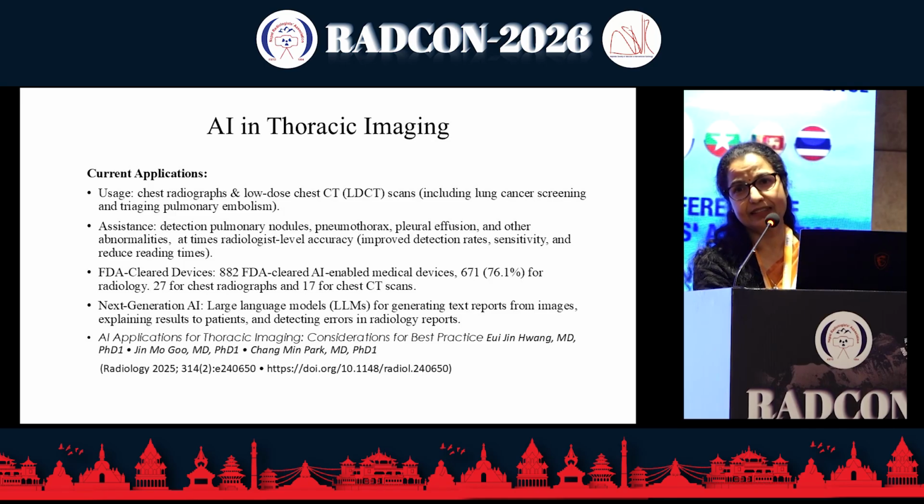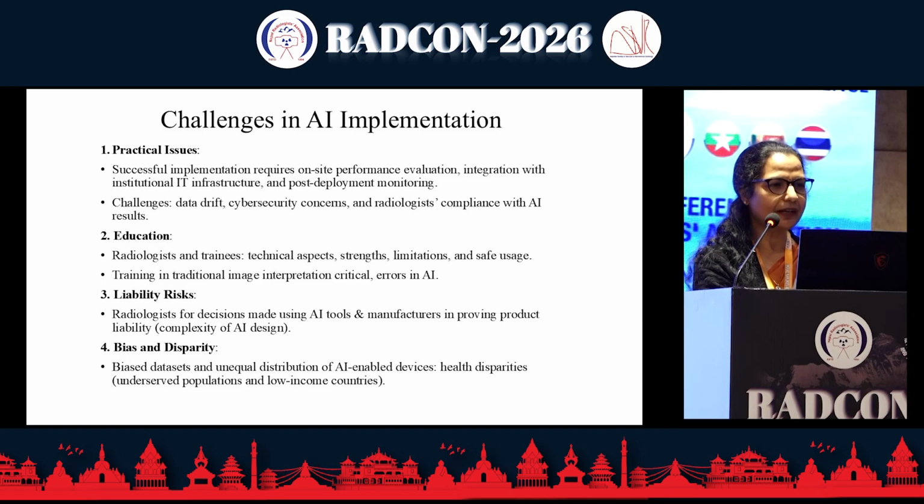However, there are challenges in AI implementation because there are practical issues: educating the radiologists and trainees. There is liability risk as well as bias and disparity. We have to have on-site performance evaluation. We have to integrate with the IT infrastructures. Post-deployment monitoring is also important, and there are also cybersecurity concerns and radiologist compliance. Even though we can train the radiologist, technical radiologist, and the radiographers.